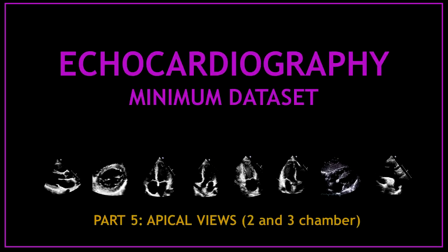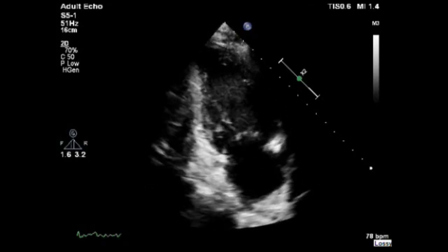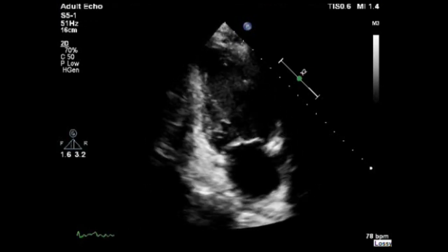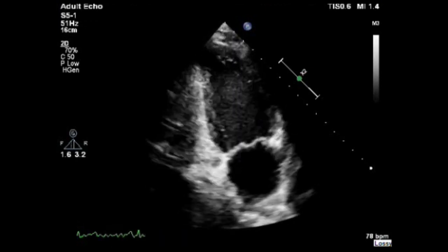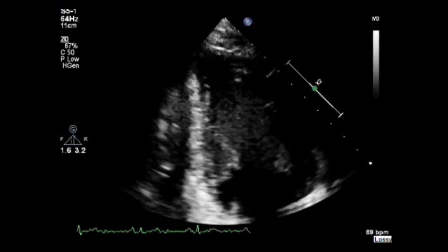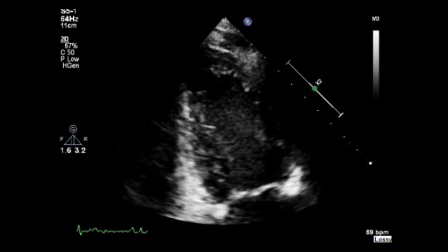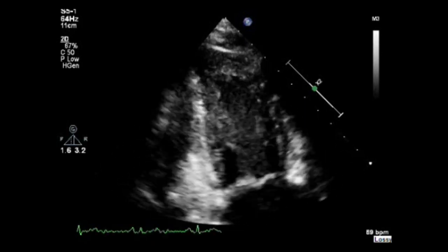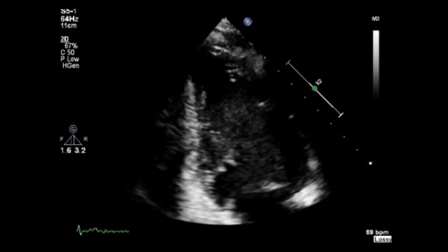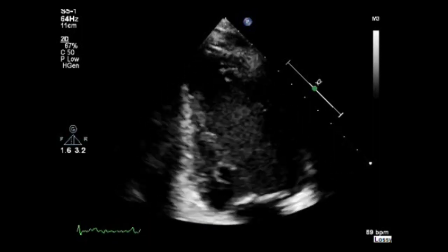Now I am going to show you on a video all the minimum data set you need to obtain when you get to the apical 2 chamber and 3 chamber views. Let's start with the apical 2 chamber view and perform a visual assessment of the cardiac chambers — the left ventricle and the left atrium. Assess the mitral valve anatomy, the pericardium, and the appendage. Now obtain a zoom view of the left ventricle and visually assess the inferior wall motion and the anterior wall motion, looking for any regional wall motion abnormalities of the basal, middle, and apical segments.